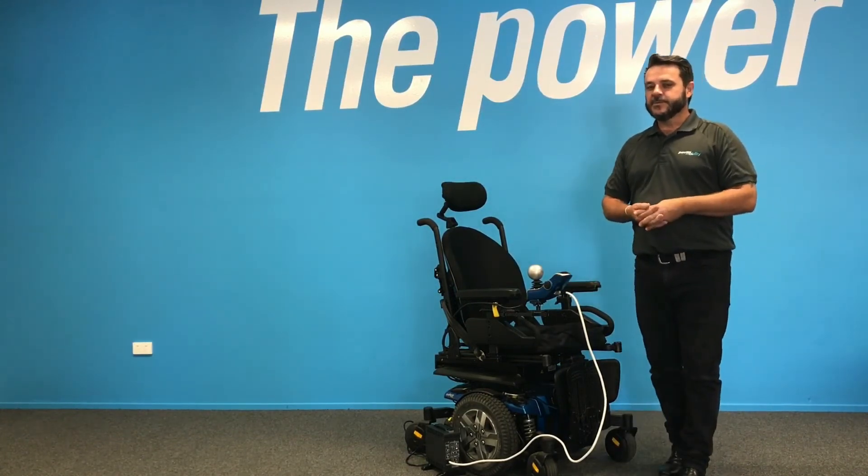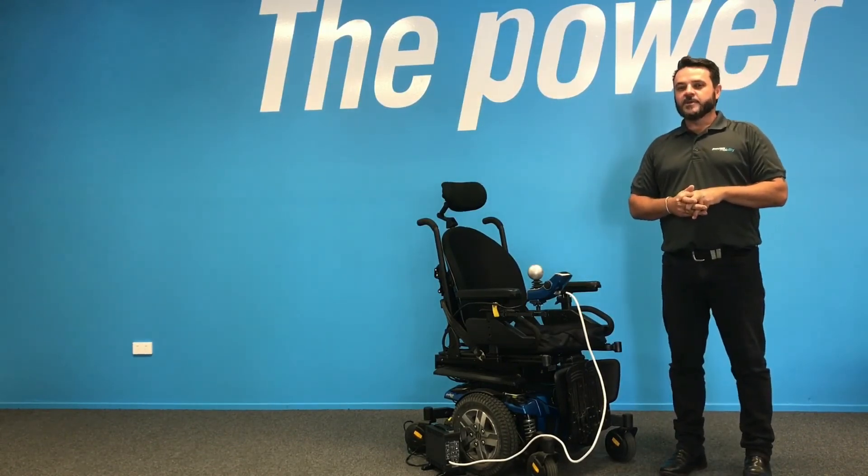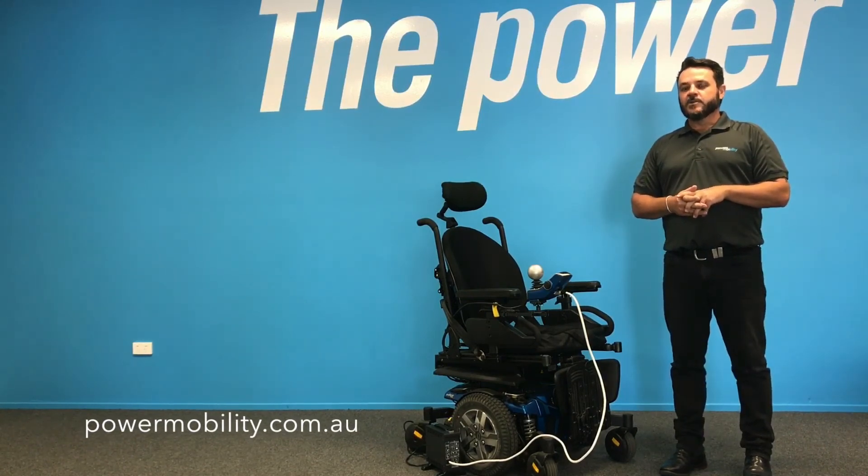So there are just a few tips for actually charging your chair. If you'd like any more information, you can drop into the showroom in Geelong or have a look on our website at powermobility.com.au.